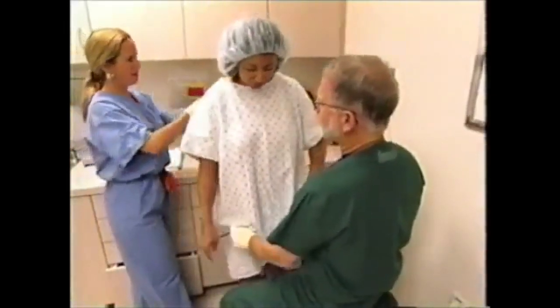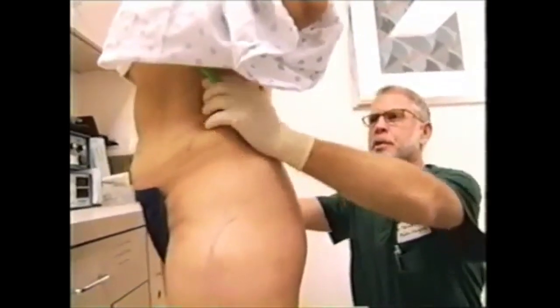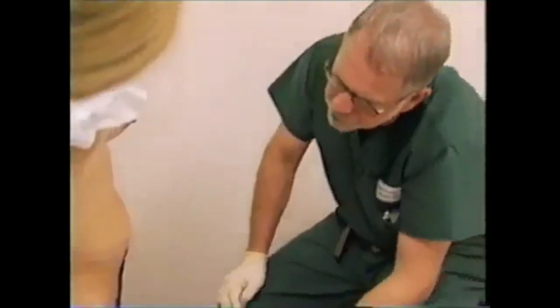I'm going to have you swing around here. Yeah, just lift this up. Right. Are you comfortable like that? Yeah. Okay. I'm going to try to give a little more of that hourglass look by getting into the flank area here. But this makes a nice difference when we do this. You can just see as I squeeze her with it. That's going to be very nice. That's a good area. It works well. And then we're going to do your inner thighs and your knees. Take good care of it. You're getting a nice result. My stomach is calm. I feel calm.